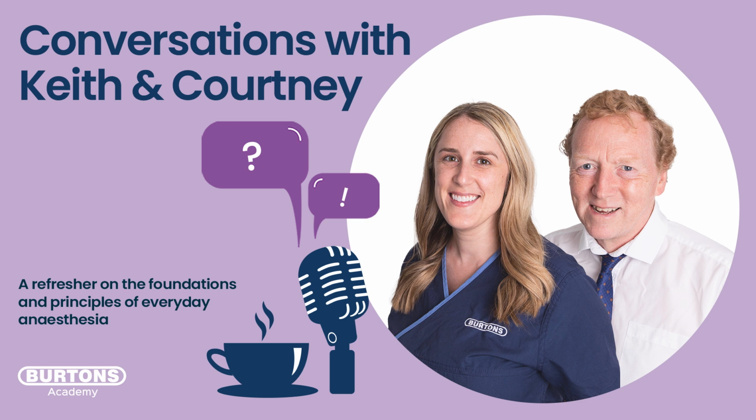And you also mentioned last night that by then, something's happened. They've used up all of that really rich oxygen in their functional residual capacity, or functional reserve. And then finally it gets way out to the periphery for us to read, and it's low. So actually, it could be a delay of like 30 seconds. So if you truly see those problems, hurry, because it happened a while ago.